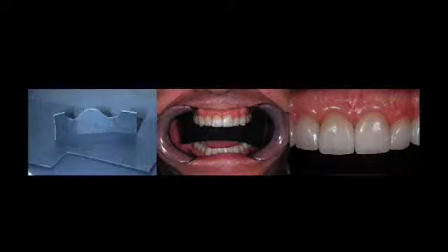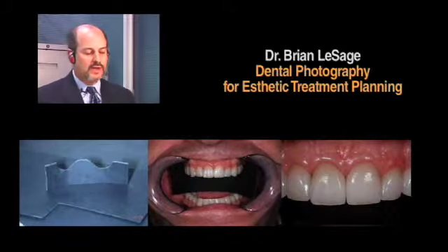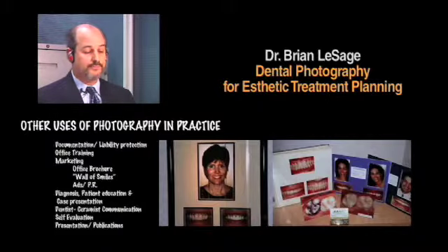This isn't real thick, but it's fairly stiff. And we just cut it out for the palate right here. This is how it looks in the patient's mouth, and this is how it looks when I shot it. So it's just a piece of cardboard, and we throw it away when we're done. I've actually taken the same example and used black foam. That's the level that I'm at now in the office. I cut out foam and put it in there, again from an art store.